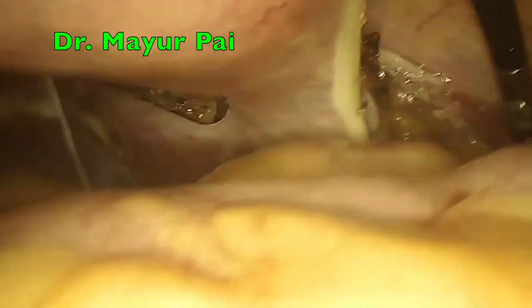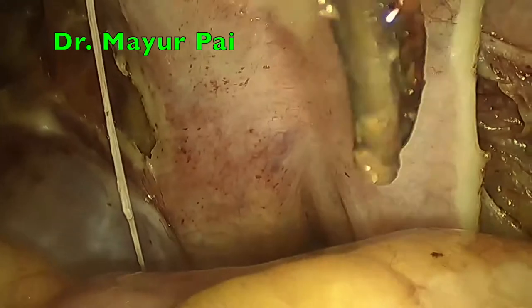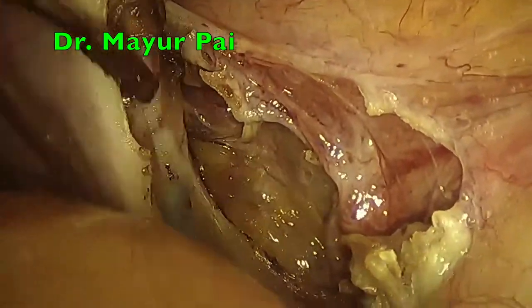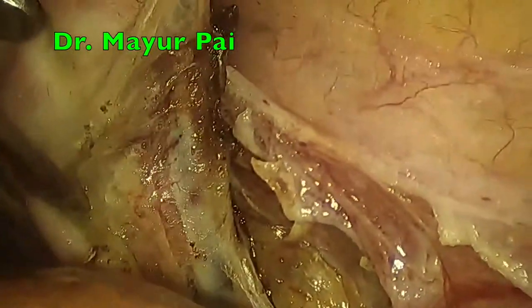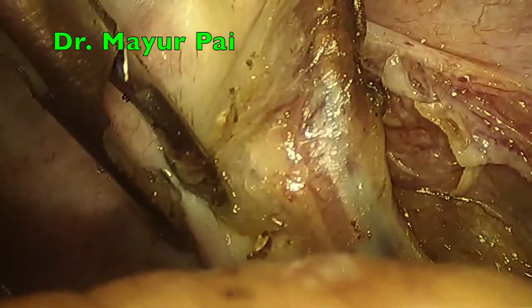Now we are just changing the position of the uterus and we are anteverting it, meaning we are exposing the rear of the uterus. We just have to connect the right and the left side. So we just have to connect the dots. While doing that, we can even cut the ligaments. These ligaments are called the uterosacral ligaments, which are the strongest ligaments holding the uterus in its place.